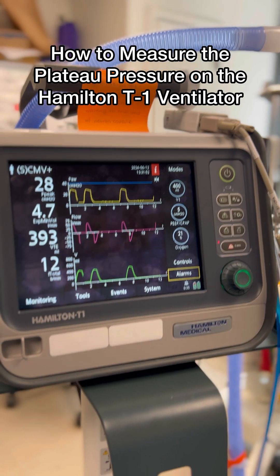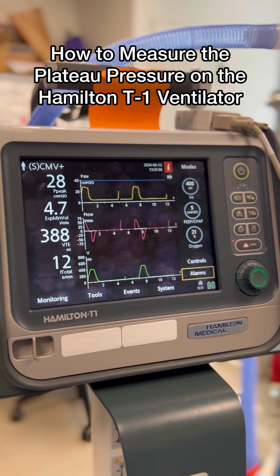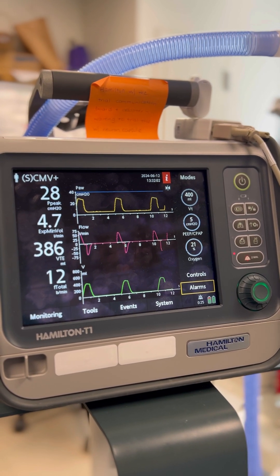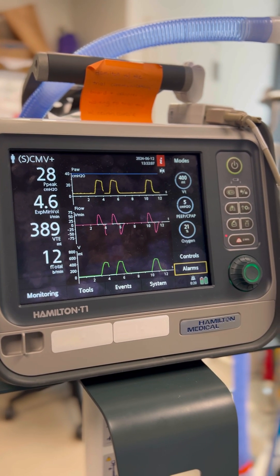Hi team. We're going to be going over how to see what your patient's plateau pressure is on the Hamilton T1 ventilator. Unfortunately, there isn't an inspiratory hold maneuver like we're used to on the Servo U. However, there is an easy and quick way to get plateau pressures for our patients.